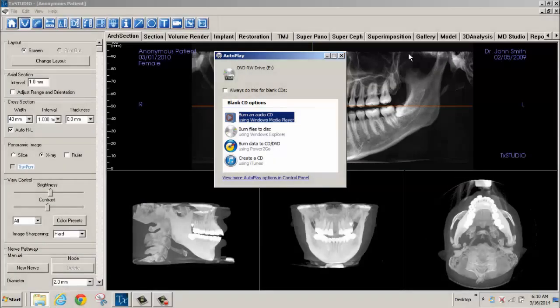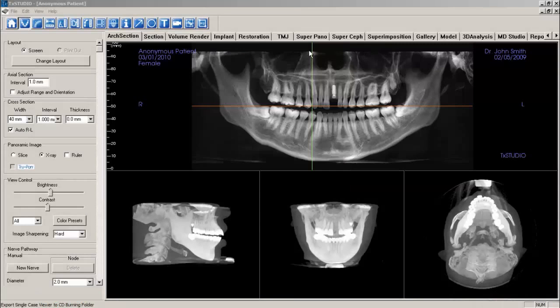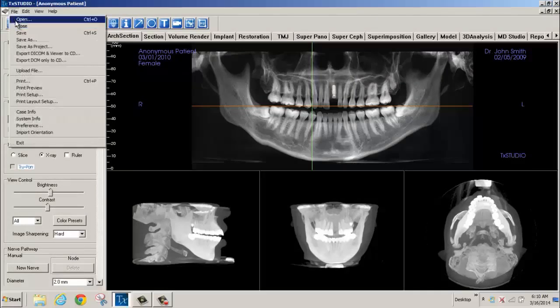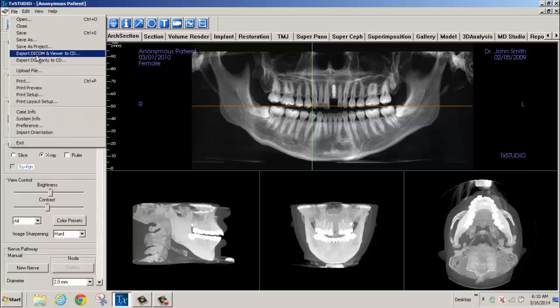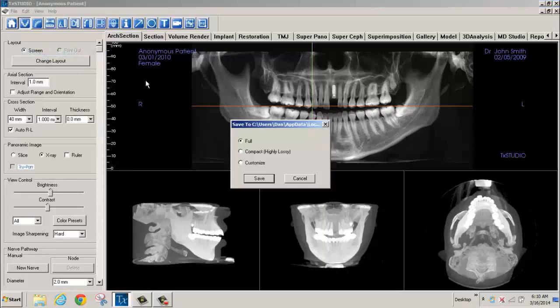An autoplay pop-up window will appear where you will click on the X to close. Select File on the menu bar and choose either Export DICOM in Viewer to CD or Export DICOM only to CD.